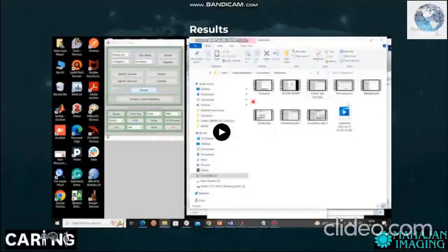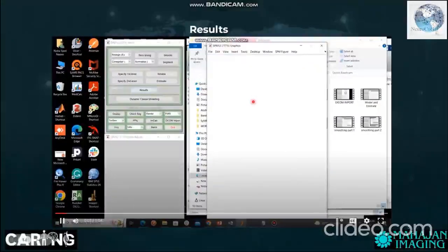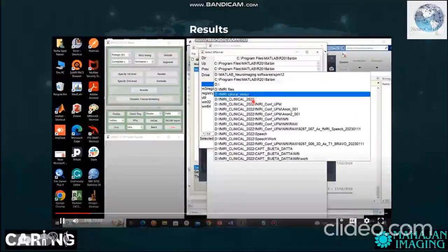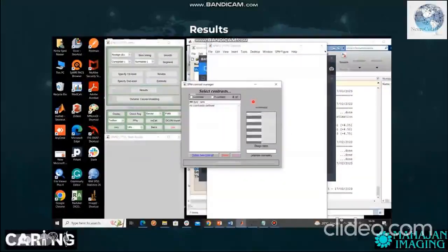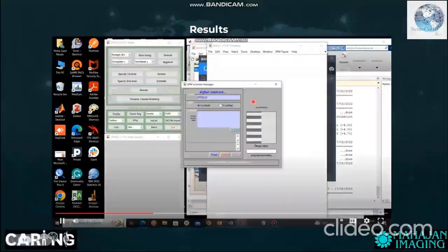So the neuronal activity in response to an experimental task is obtained by specifying the linear contrast, that is either the T contrast or the F contrast. So to do this, you have to click on results and go back to the directory which has the .mat file. Click on it, done, okay. Go to T contrast, type the name of the contrast. Here we are having only one experimental condition, that is a speech. So I'm just typing speech.